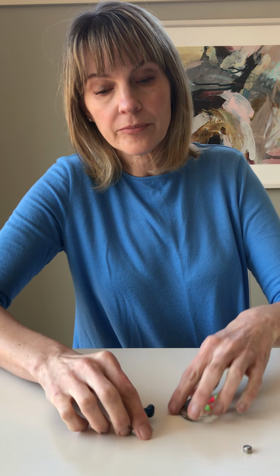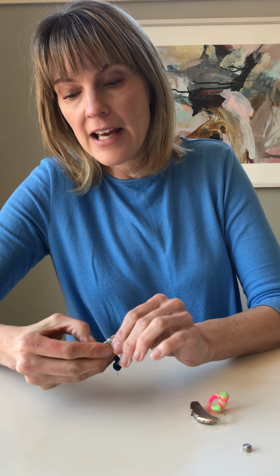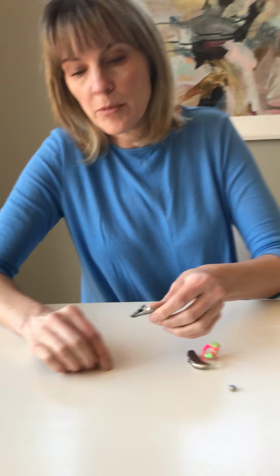If I've done that and I find that the hearing aid is not working at all or sounds quieter than usual, or if my child is reporting that the hearing aid sounds quiet or is not working at all, then I need to do some troubleshooting. The first thing that I would look at for a hearing aid that's not working is the battery. So batteries have a nice mnemonic, and that mnemonic is bad batteries bounce.